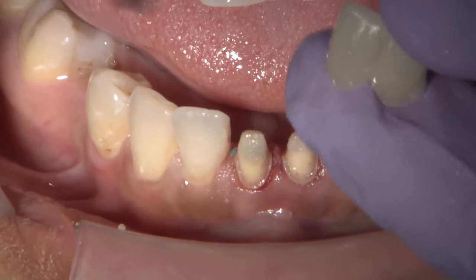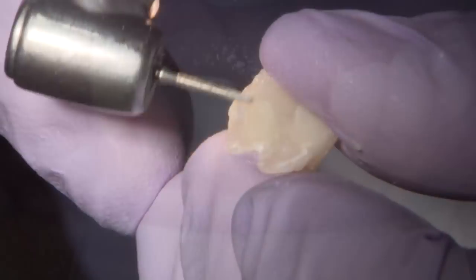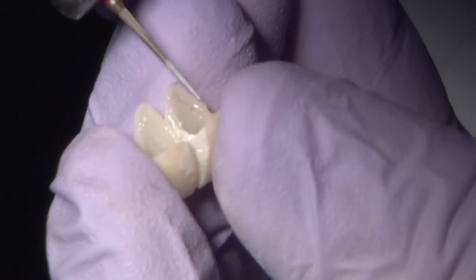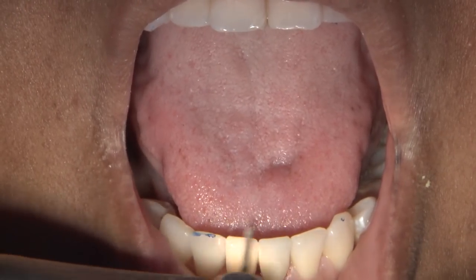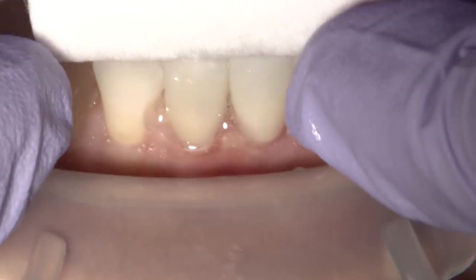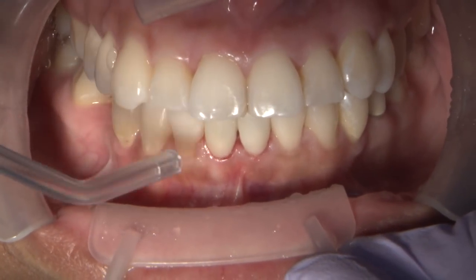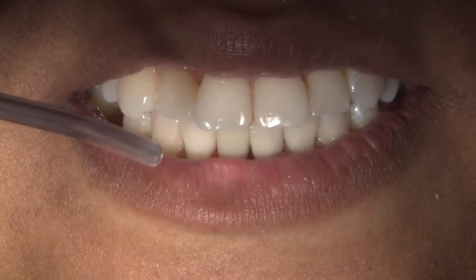Light pressure to unseat the BioTemp, and any remaining blockout can be flaked away from the margins. While adjusting the margins and flash, I want to make the point once again and show how well the excess acrylic was trained to flow into the BioTemp shell and away from the adjacent teeth and embrasure areas. I will always go back to the thin flame diamond burr and continue to open interproximal areas of splinted units, being careful not to over-trim the margins. Dry seating and checking occlusion even after stent placement is beneficial, as this temporary needed a spot adjustment. The application of Temp Bond Clear Cement was a good choice here due to the thin shells and light overall shade of the arch. When splinted embrasures are open to satisfaction, the practitioner and patient should both be able to insert a floss threader with ease. The final product is a success, and the Fast Stent is available to fabricate a backup chairside temporary in the improbable instance that a catastrophic failure of the BioTemp were to occur in the meantime.